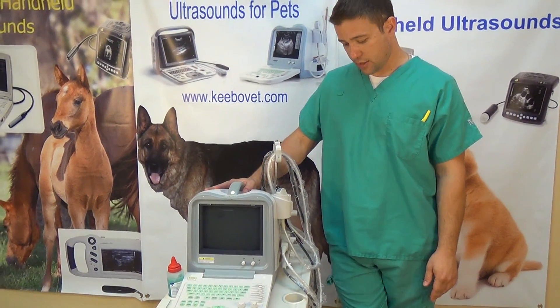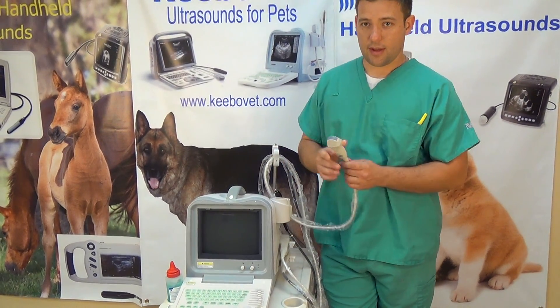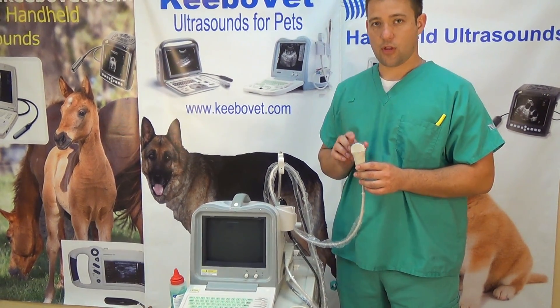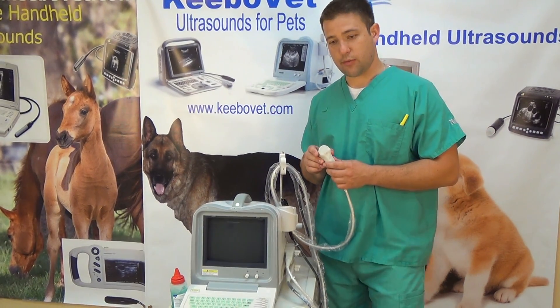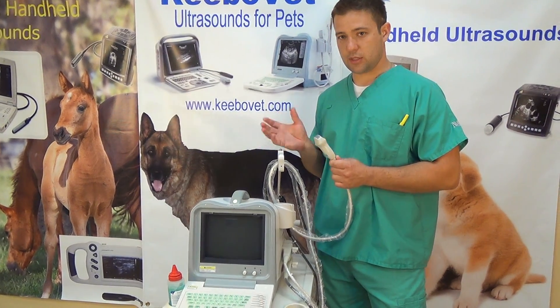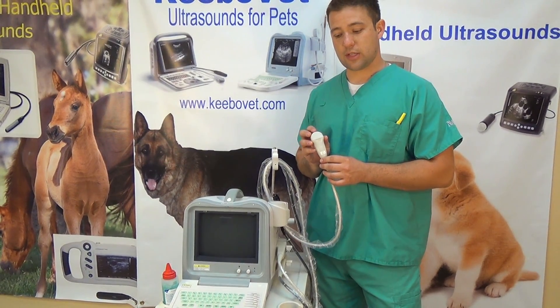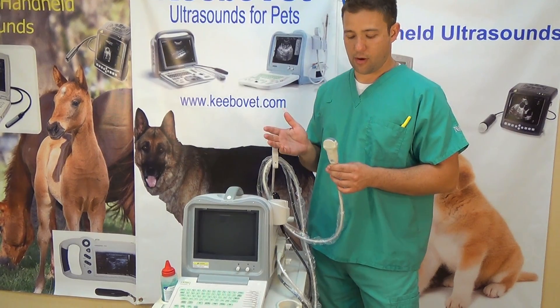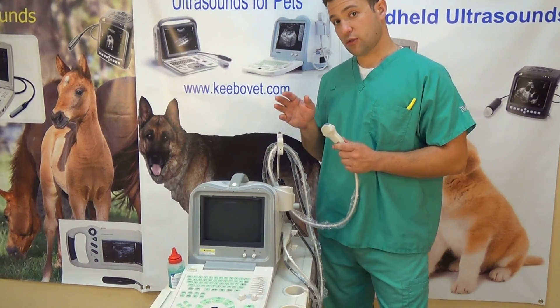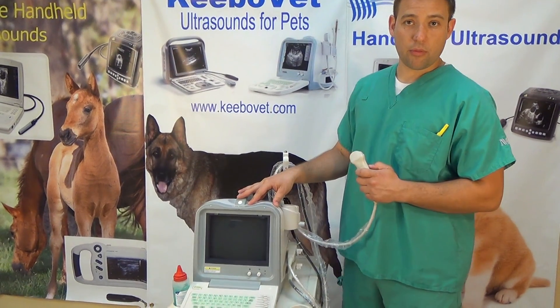This machine is good for both large and small animals. The curved probe here is a microconvex, and it has a frequency range from 5 to 8.5 megahertz. That's a higher frequency which means higher resolution and better image quality. A lot of the other competition machines, such as the WED918 for example, have the same type of probe except the frequency is a lot less — closer to 3 to 5 megahertz. That provides much lesser quality images, especially for smaller animals. So while that's okay for large animals, this one lets you do both, so it's the best of both worlds.